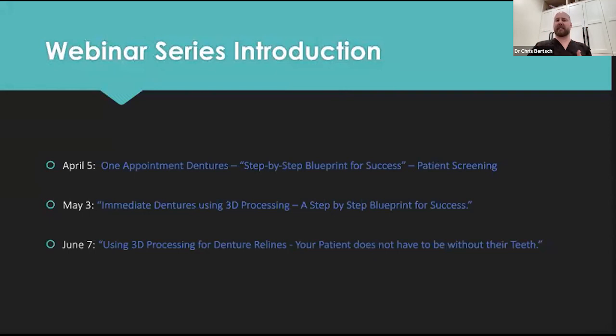So that's when I take pictures, I take a scan of the denture, and in that time I would do a try-in. I just ask them with the pictures, they can see, you can't see the patient's teeth. So then I ask for 4 millimeters, whatever it may be, to increase. As long as you have a stable bite at the first appointment for the immediates, I just go with that bite because you know it's going to change and shrink.